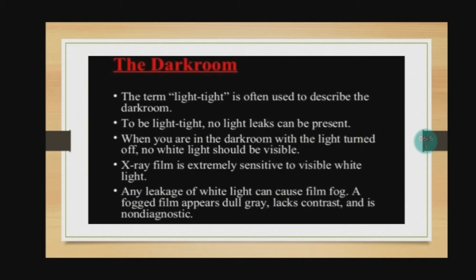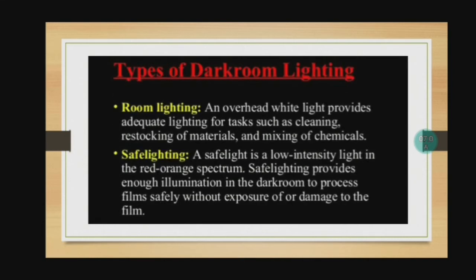So the X-ray film is extremely sensitive to visible white light. Any leakage of white light can cause film fog. So a fogged film appears dull gray, lacks contrast, and is non-diagnostic. Types of darkroom lighting. So first, the room lighting.